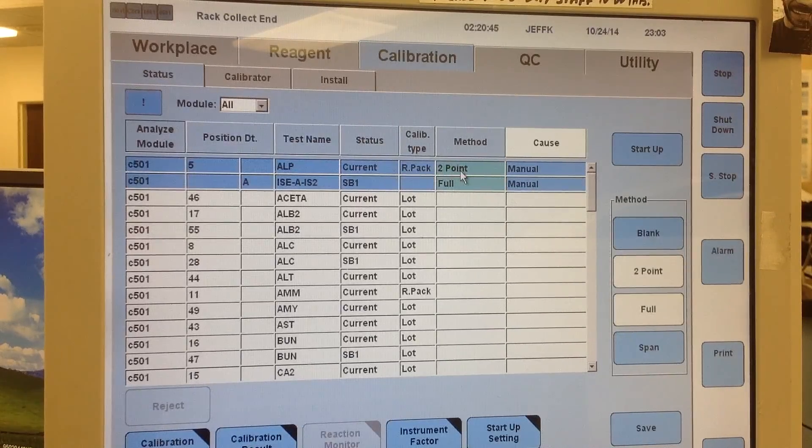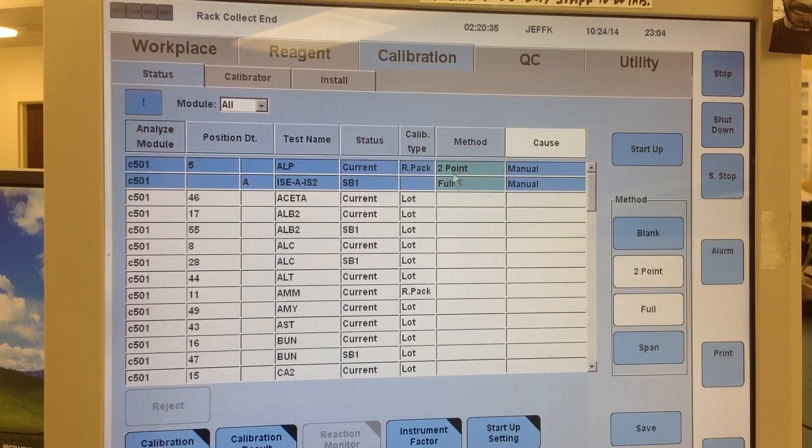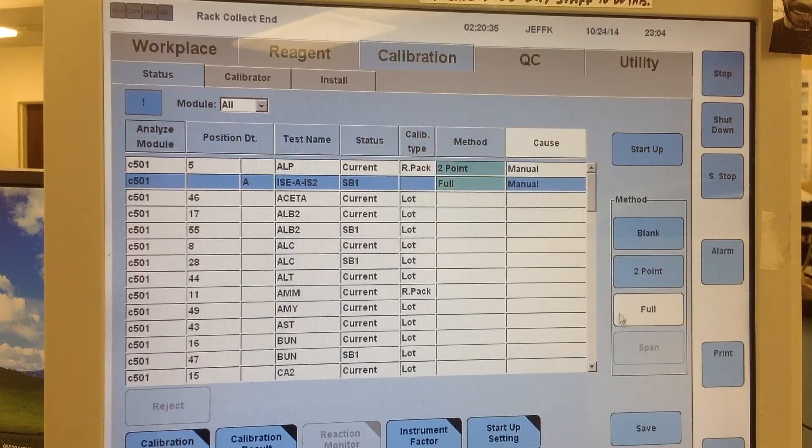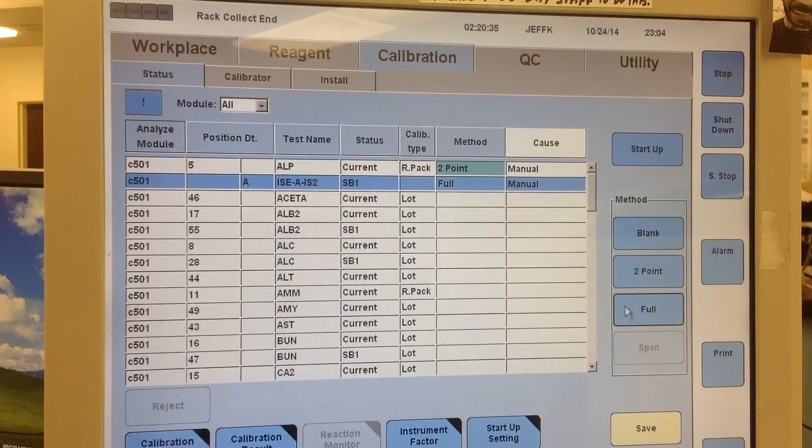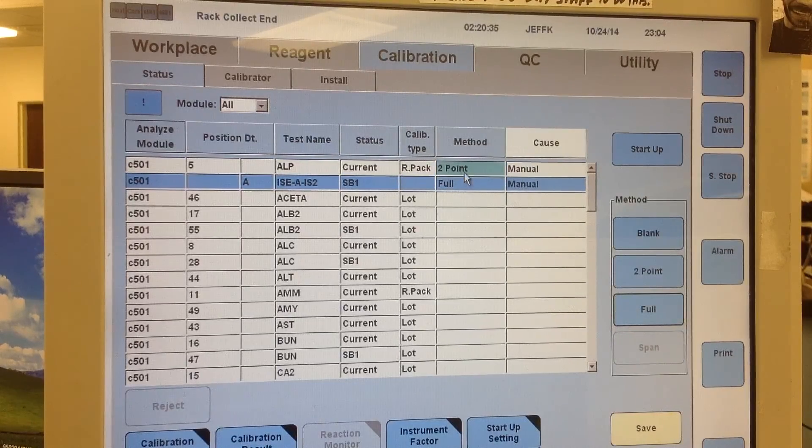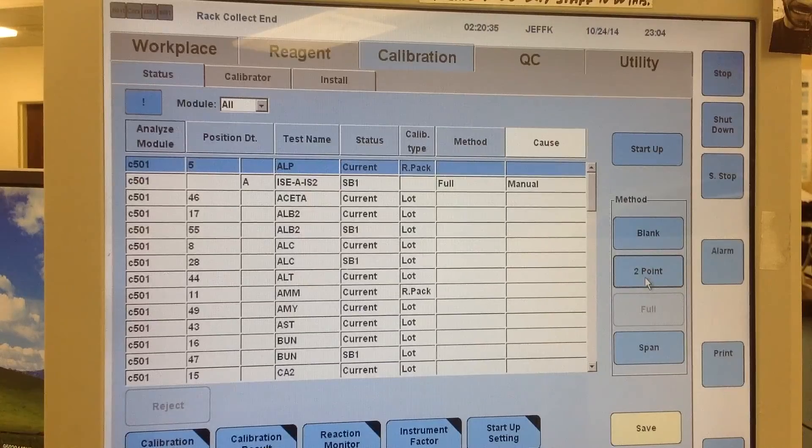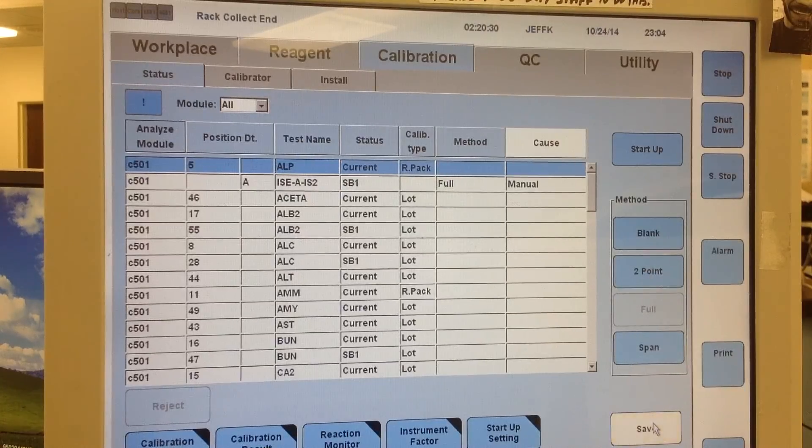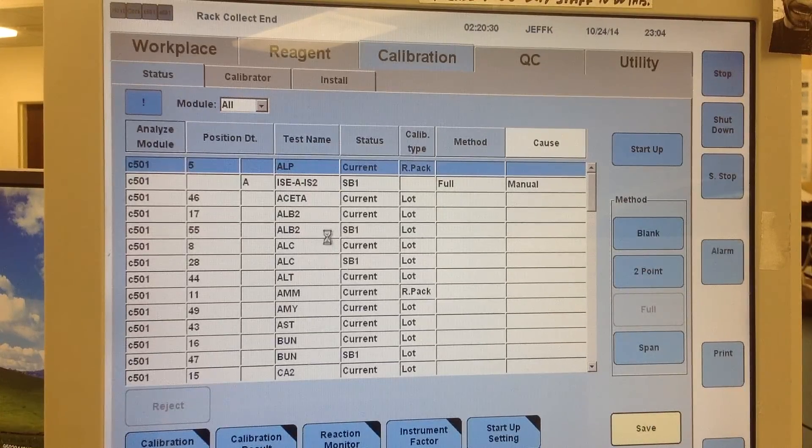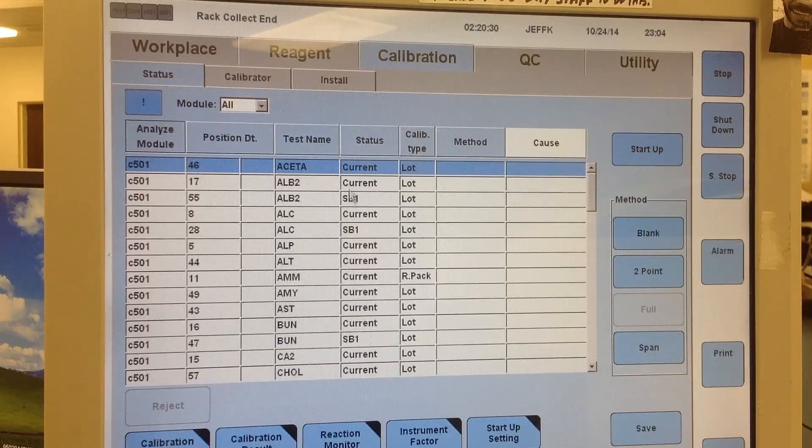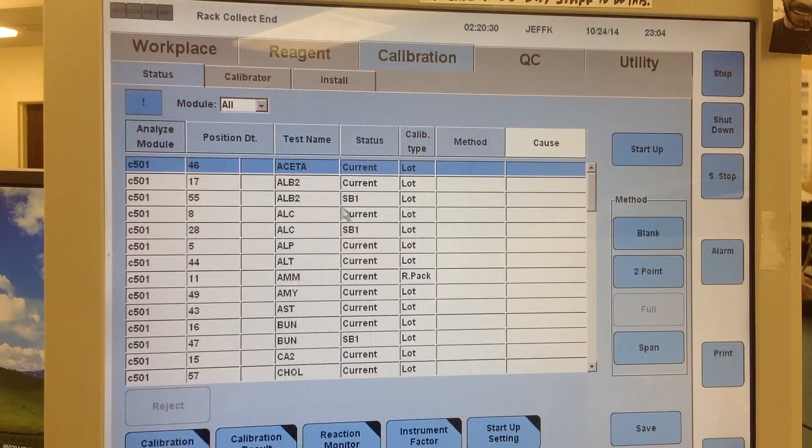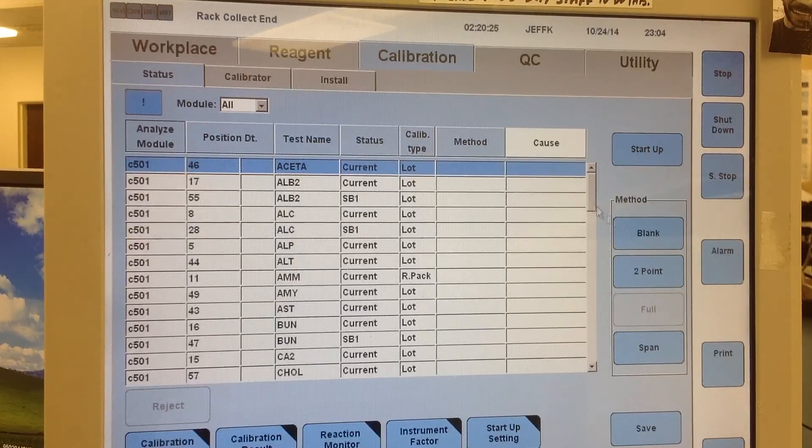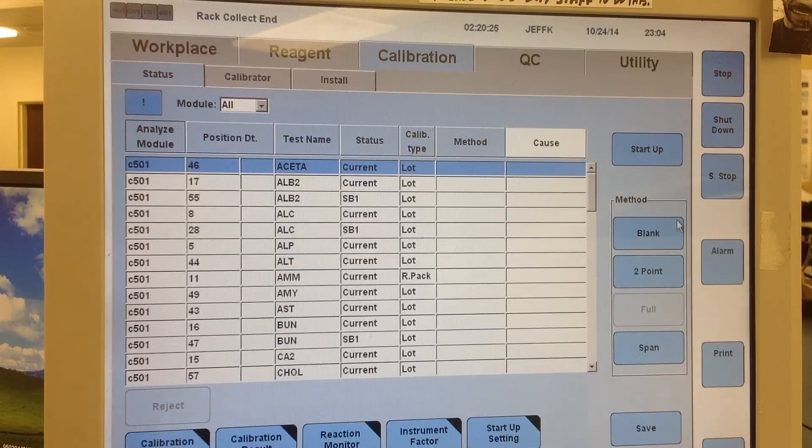Now if I wanted to unorder them, I would just select them again. Hit full for the one that's ordered as full, 2 point for ALP, and then you just save it. And that would unorder them. So there you go, that's how you would do individual tests and QC.